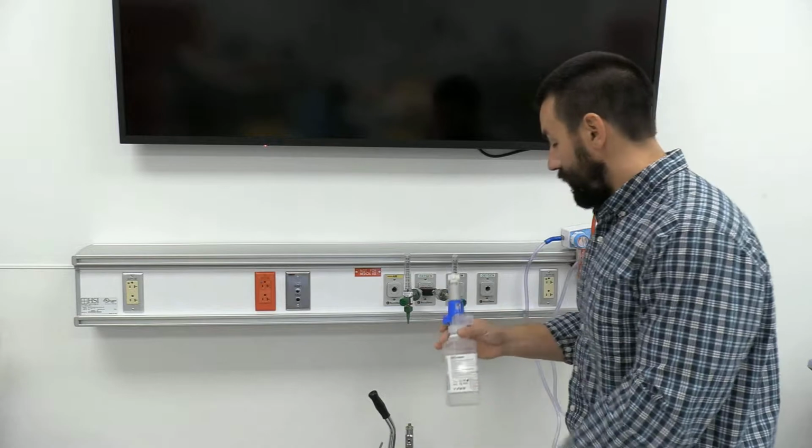Now, as we get this thing set up and running, I'll tell you, everything as far as meeting or exceeding that patient's flow requirement before was something that was theoretical. We picked 60 and we talked about where that 60 liters a minute of total flow comes from. With having an aerosol, we have a different little trick we can use here.